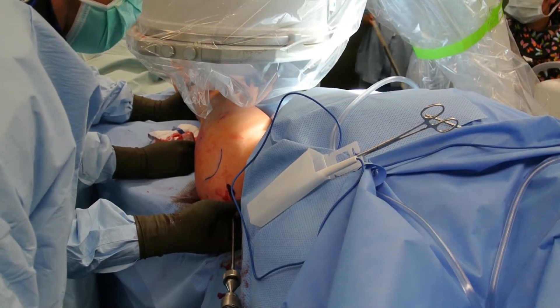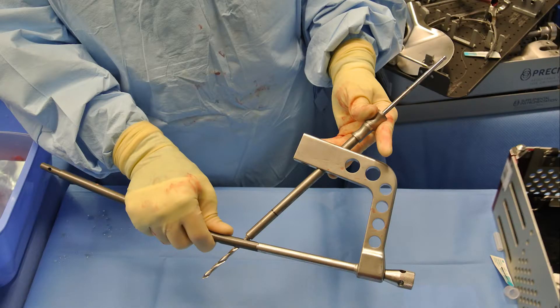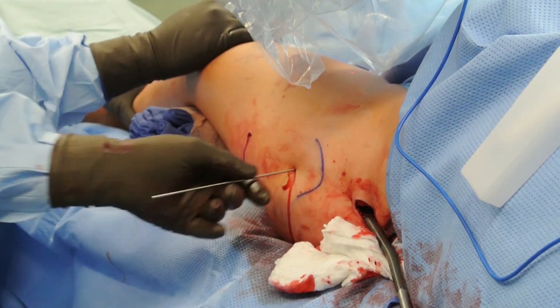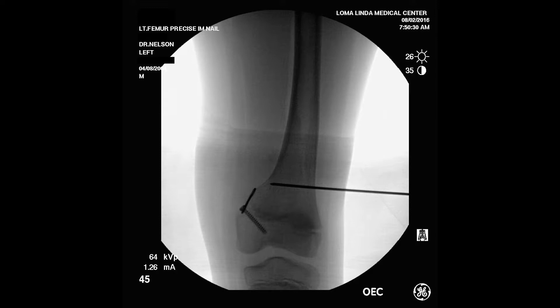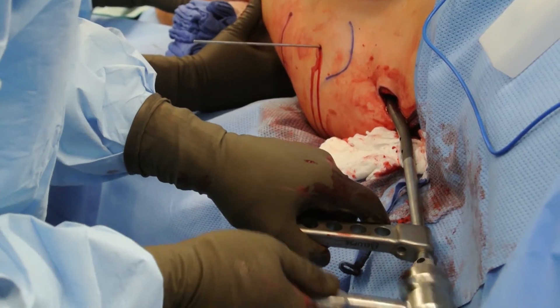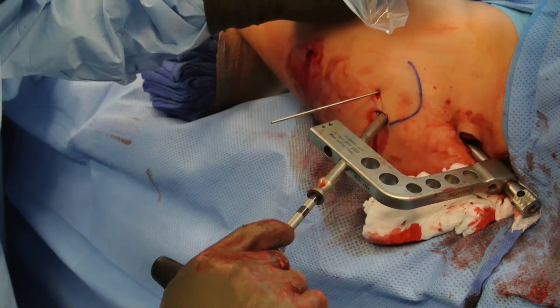Flexible reamers are then sequentially placed over the guide wire. Once diameter is confirmed, the implant is opened and loaded on the insertion device. It is important to confirm the alignment of the proximal interlock cannulas before placing the nail into the patient. There is very little margin for error with this device as the size of the interlocking peg has been maximized and the interlock screws must be placed very accurately. After advancing the implant into the proximal aspect of the femoral canal, a robust derotation guide wire is placed just anterior or posterior to the nail in the proximal segment, and a second one is placed in the distal segment, distal to the planned location of the tip of the implant. The corticotomy is then completed with a half or quarter inch osteotome and the nail advanced into its final position. It is very important to confirm that the osteotomy is complete. The proximal interlock pegs are then placed using the insertion jig.